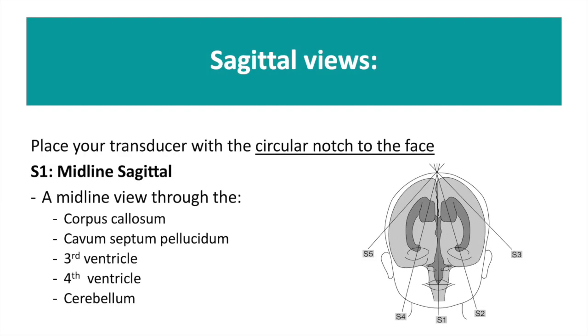The next views we want to obtain are the sagittal views. To do so, turn your transducer through 90 degrees so that the circular notch is towards the baby's face.